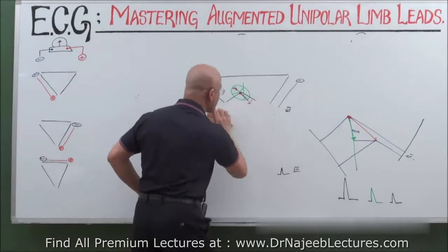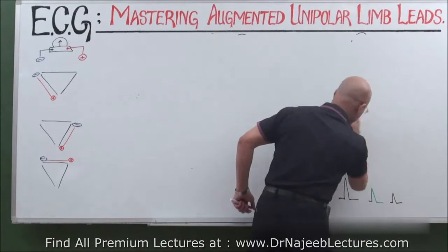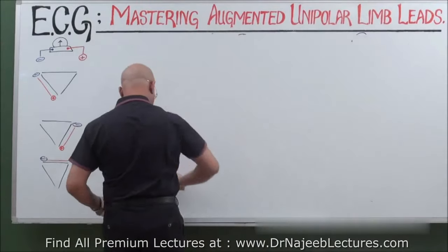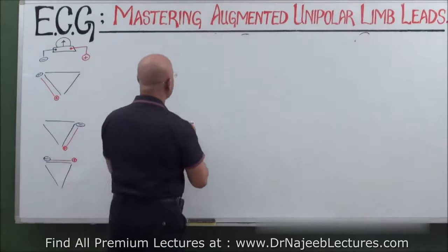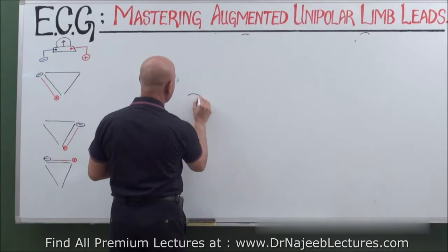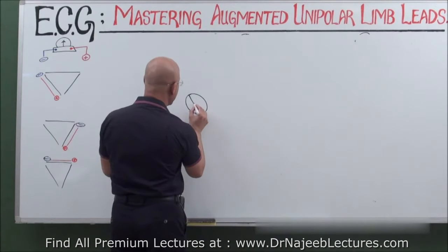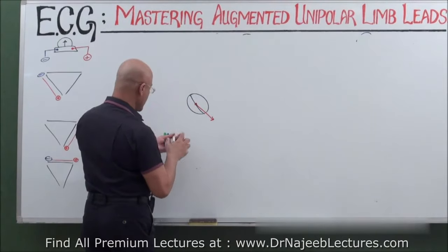And that interesting thing is, this is your heart, right? Here is major ventricular depolarization, but actually, right?